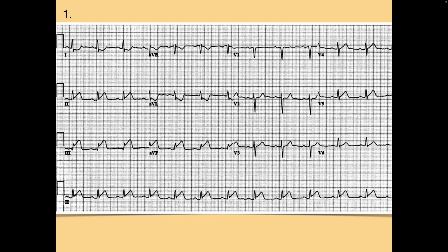Here at 3. And then can we use AVR since it's just upside down too? Or no? No, don't use AVR on this. And then AVF. Okay. Yes, so we absolutely have elevation in 3 and AVF, and 2 is a little bit equivocal. We don't need it because we've got 3 and AVF. You can sort of see, it depends, is it this one or this one? This isn't quite good enough to get us to the cath lab, but this is, okay?